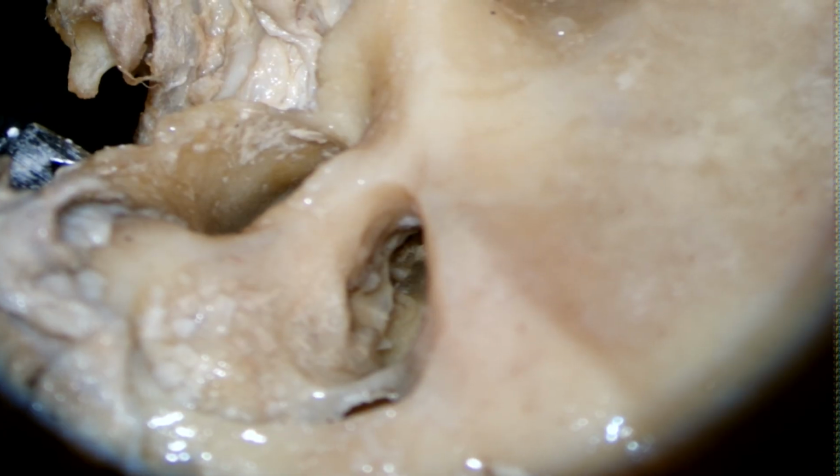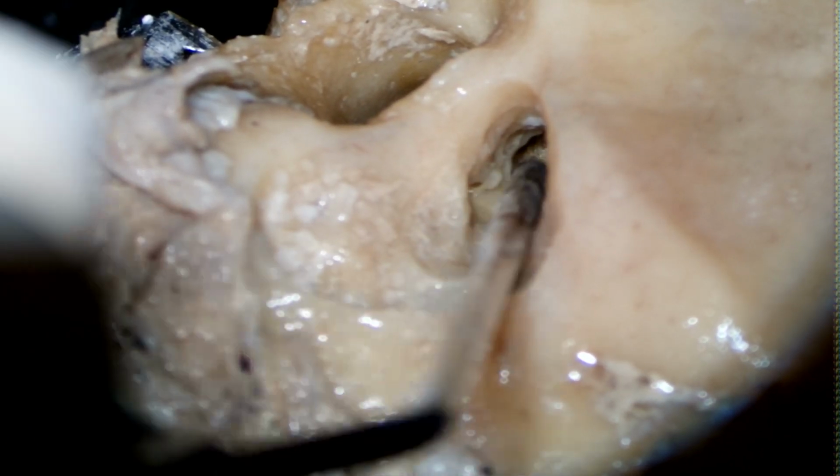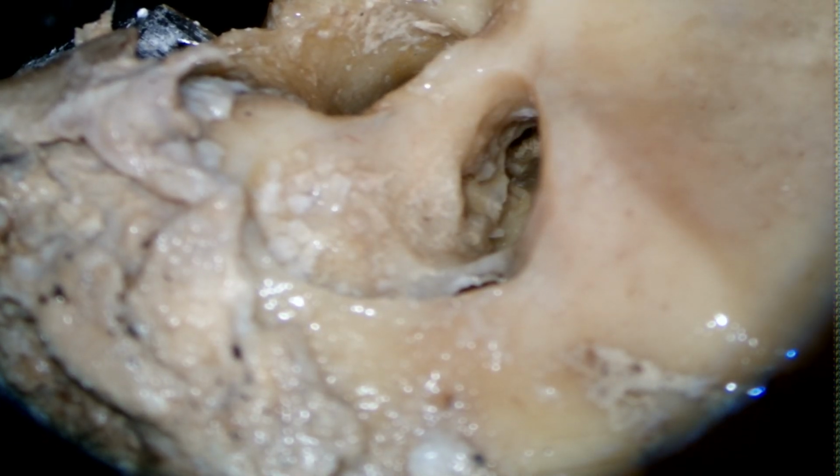Okay, sorry. So what we'll do now? We will thin the posterior canal wall now. Let me show, I need the posterior canal wall a little bigger.